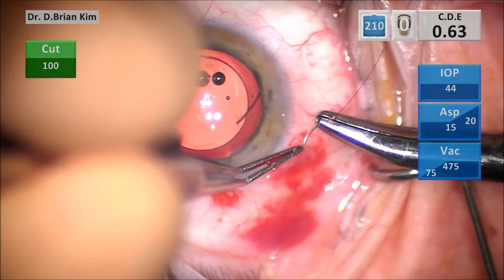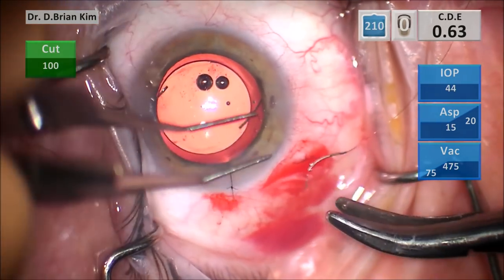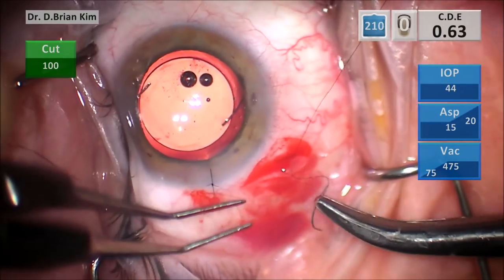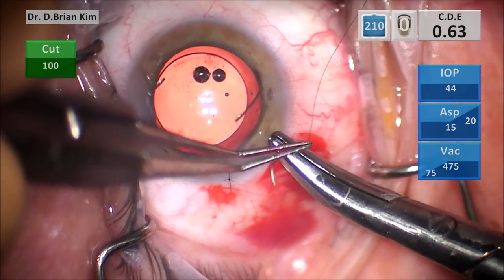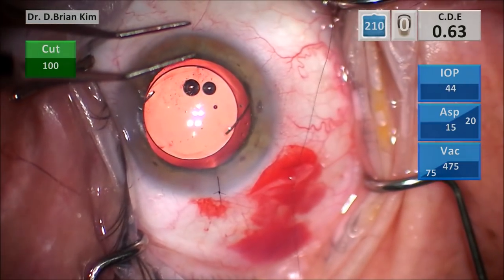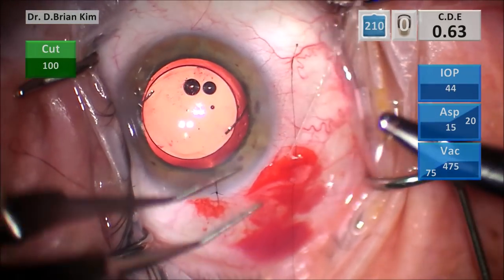And when you do vitrectomy, a pars plana approach is better because the vitreous will be going backwards towards the vitrectomy port in the pars plana space rather than coming anteriorly, which is where you don't want it to be. This gives you a lot more confidence that the vitreous will be evacuated completely and confidently out of the anterior chamber by going pars plana.